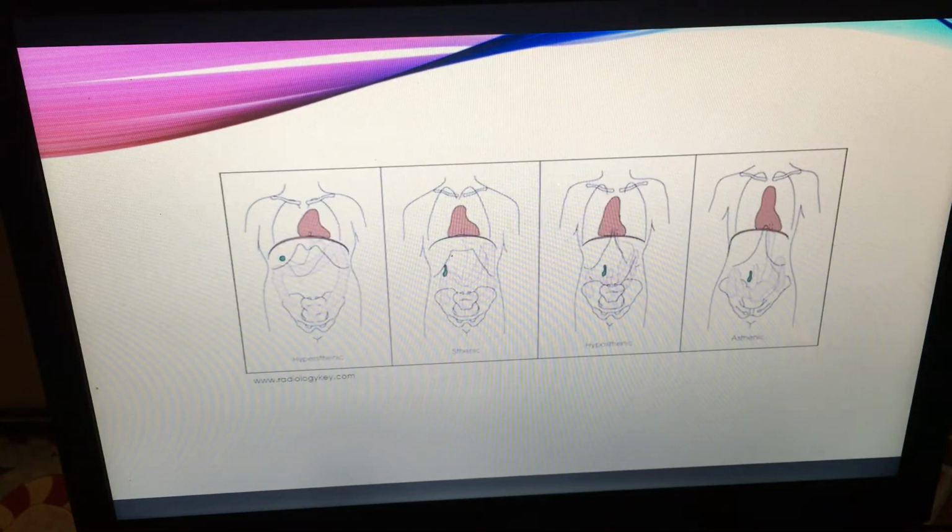Things to take into consideration when using bismuth shielding are the patient's body habitus, position, and the number of layers within the bismuth shield. Bismuth shields are placed within the imaging field of view. They are usually made with 0.85 to 3.4 grams per centimeter of bismuth within the shield. They are placed over areas of interest such as eyes, breasts, thyroids, or gonads.